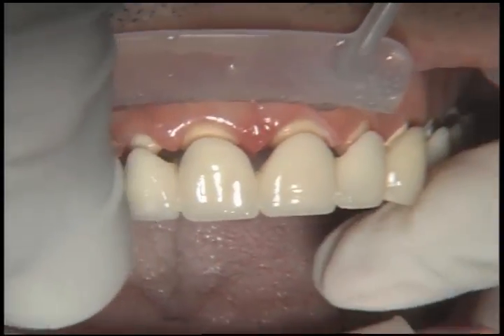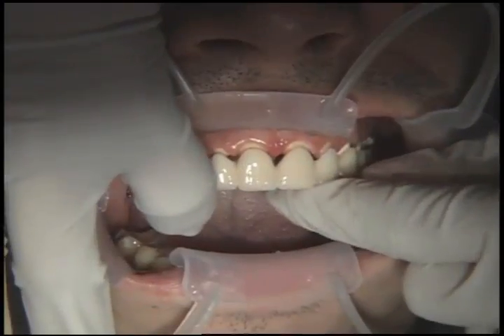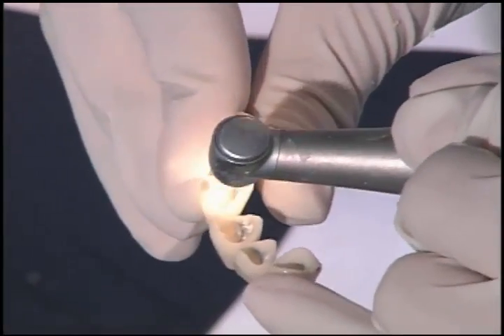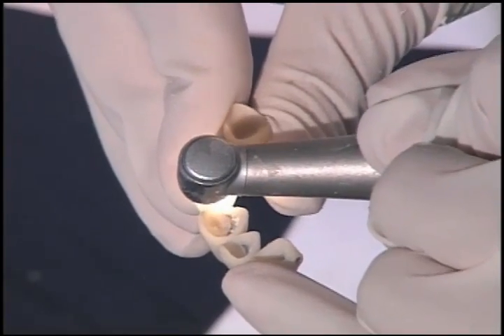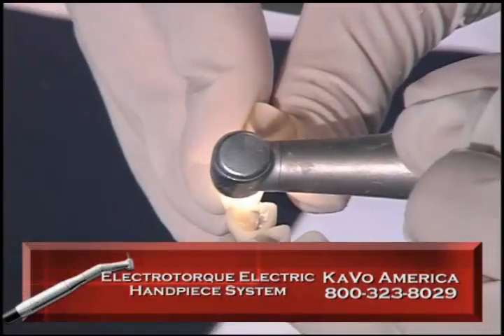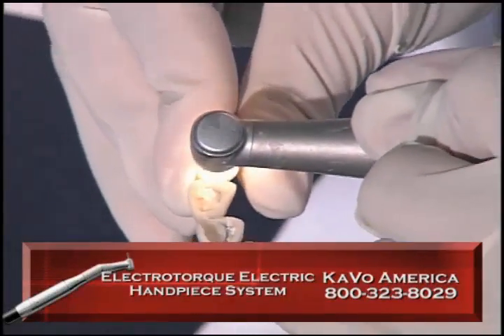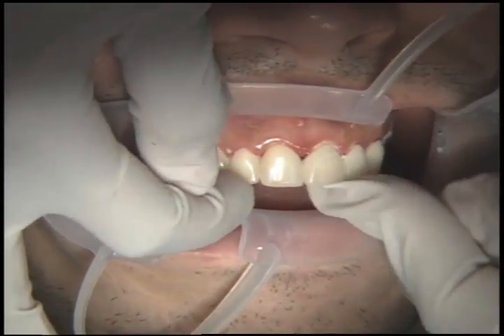When we try the biotemps back on again, of course they're not going to fit because they were relined at the last appointment for the preps before the post and cores were there. So on those four teeth, I'm taking a burr here — I've got an electric handpiece, the CAVO Electro Torque — and I've turned the speed way down. I'm using a diamond just to hollow out teeth number 7, 8, 9, and 10 and try to make them look like the biotemps looked in the beginning.